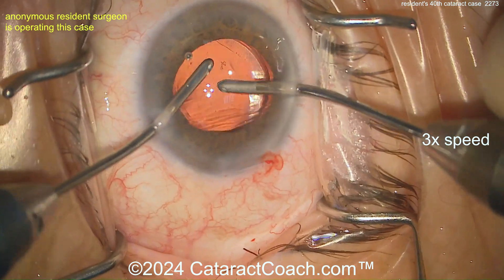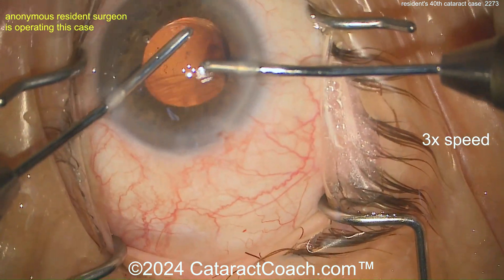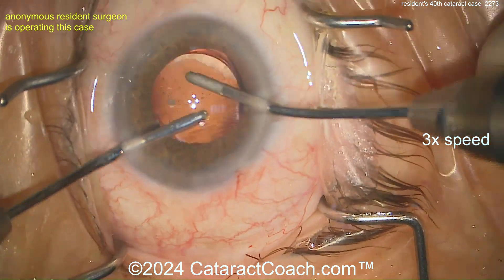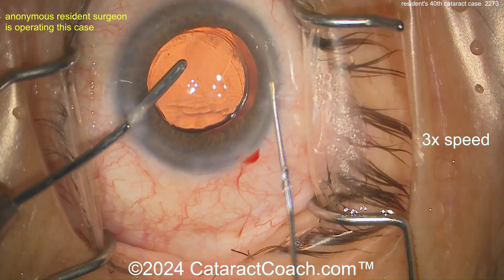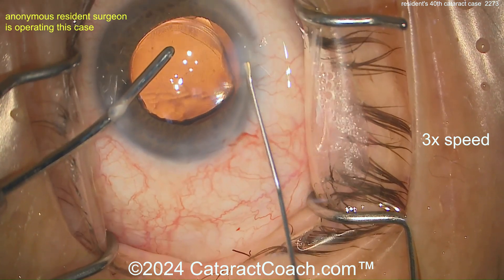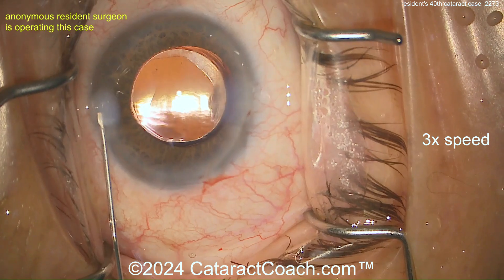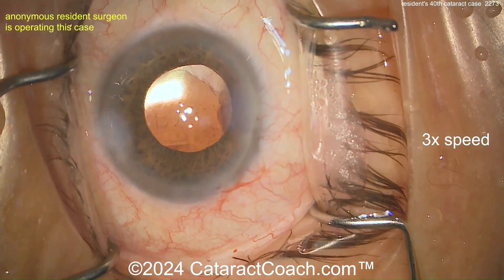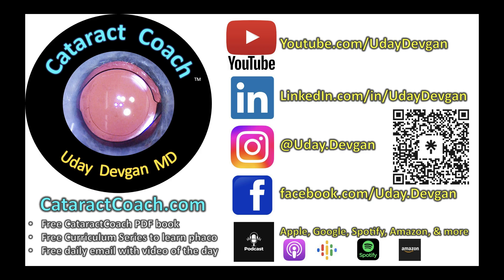Young surgeon, you are doing a great job. In your career you will have much success — I have no doubt. You took the effort to send the video in for a critique. Remember a couple weeks ago when viewers gave me grief for being tough on a senior surgeon with 200-plus cases who did a terrible job with draping? Look at case 40 — beautiful draping. The rhexis needs a little work, but you did a beautiful job. Remember, every week the Cataract Coach podcast teaches you all the secrets to success in your career.